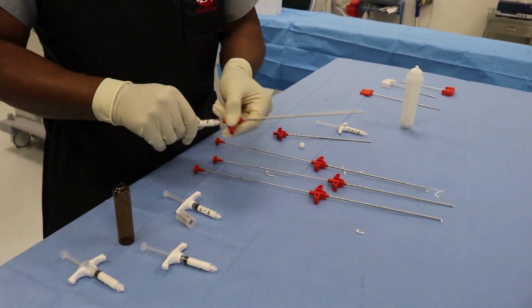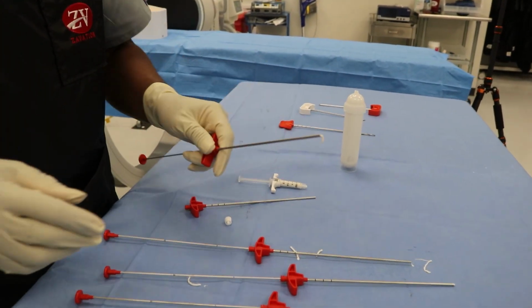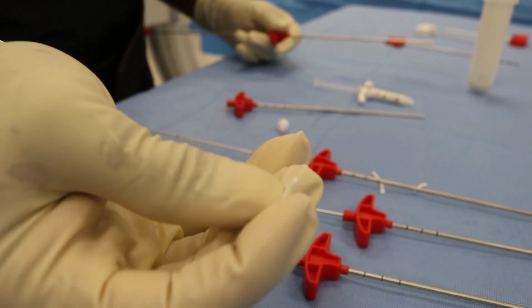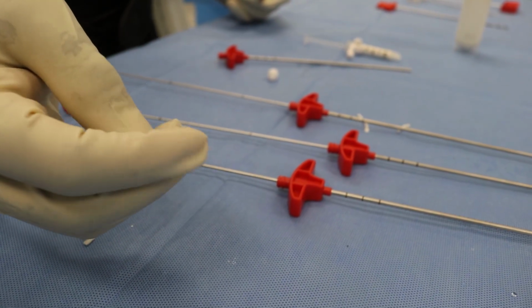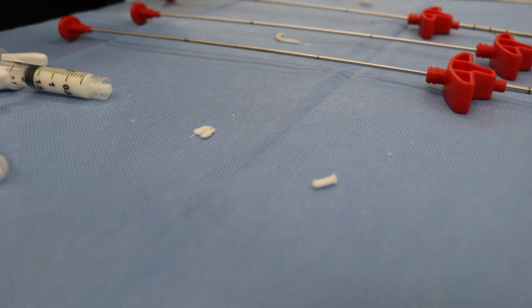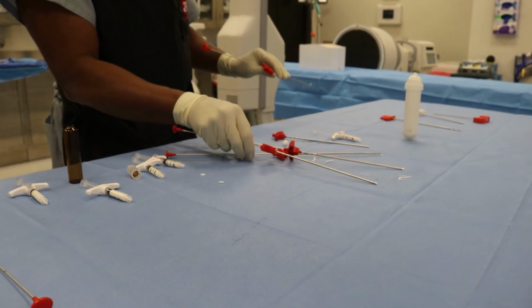At this point, we want to make sure that the cement, after the several minutes of setup time, has a consistency of toothpaste. And as you can see, it's somewhat firm but not completely solid. This makes a good consistency for us to use for the procedure. Now at this point, I'm going to begin the process of filling the vertebral body.